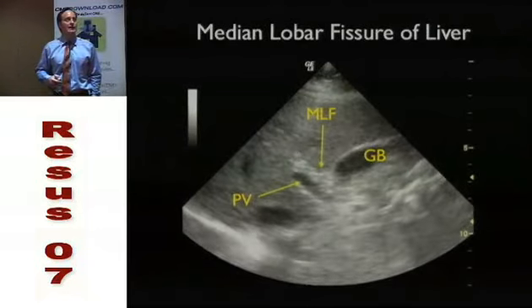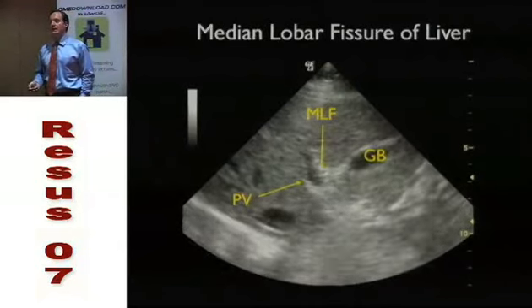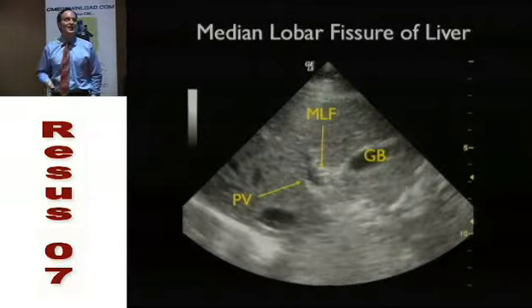Okay, so once I find that, I can walk my way up to the gallbladder, and hopefully you have a chance to do that after lunch. And you can take a look. Because some of our patients may have had a large buffet lunch, and their gallbladder may be contracted.